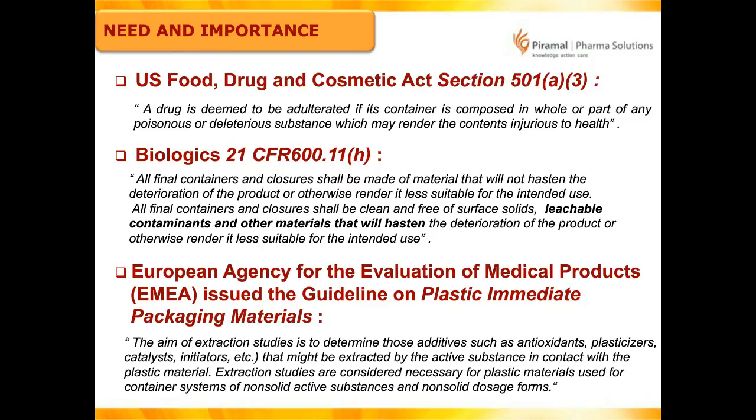These are the different guidelines. EMA is also very concerned about packaging material. The EMA guidelines say the aim of an extractable study is to determine additives such as antioxidants, plasticizers and catalysts, which can be extracted by the active substance in contact with the plastic material. The studies are considered necessary for plastic material used in container systems for non-solid active substances and non-solid dosage forms. So EMA is clearly saying that products in liquid form, whether parenteral, ophthalmic or nasal drops, all need to go through extractable and leachable studies.